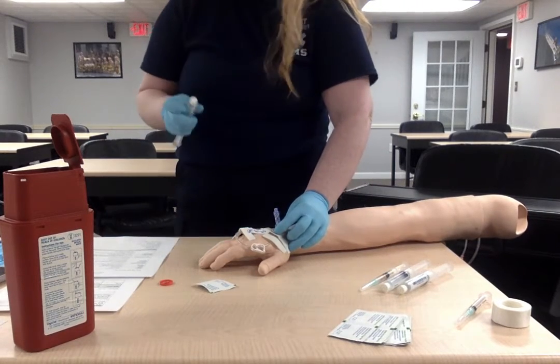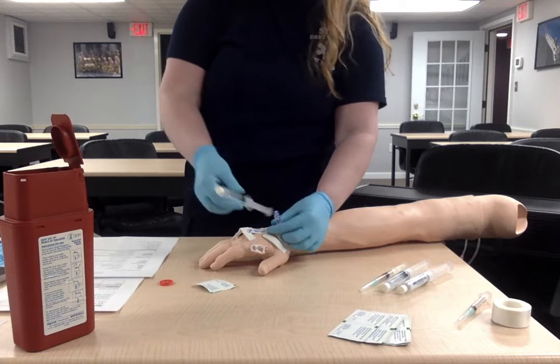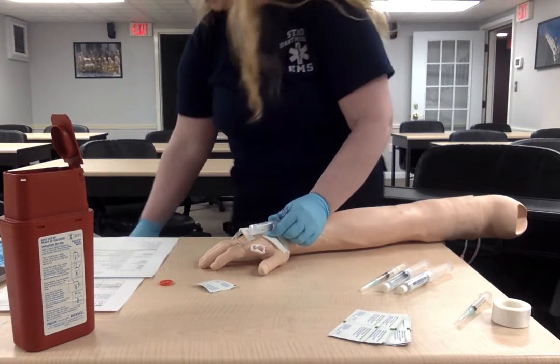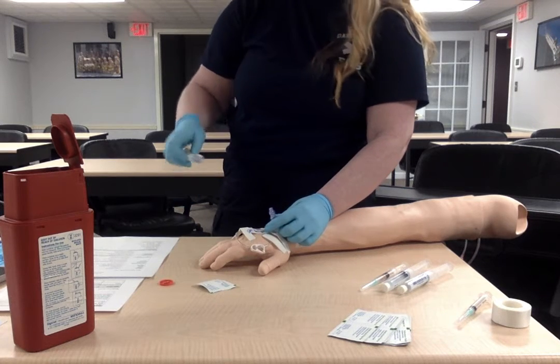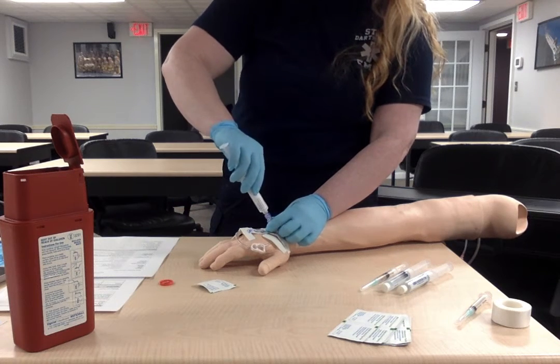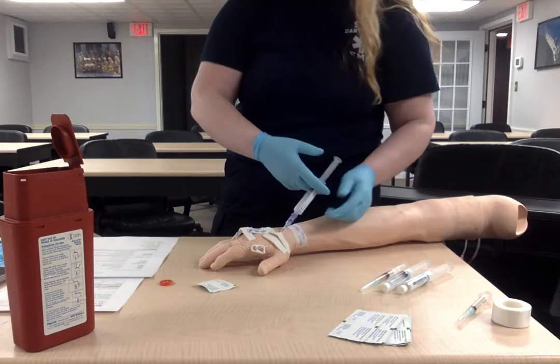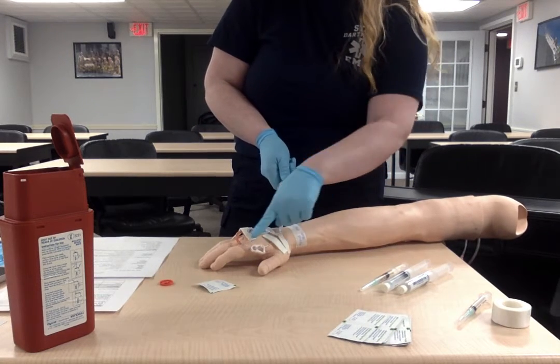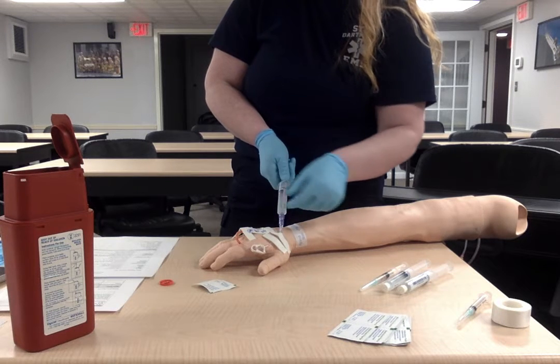At this point, we're going to insert the flush. So we know that the flush hasn't touched anything, so we can remove the top. Again, nothing's touching this, keeping it sterile. So we're going to attach this to the flush, and then we're going to aspirate. So we're going to pull back to see if we can get some blood return. As you can see here, there's some blood return.